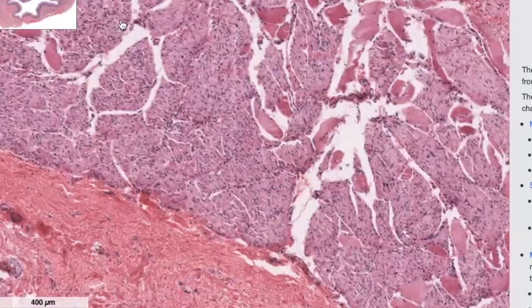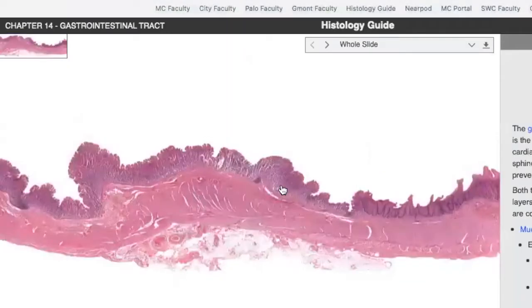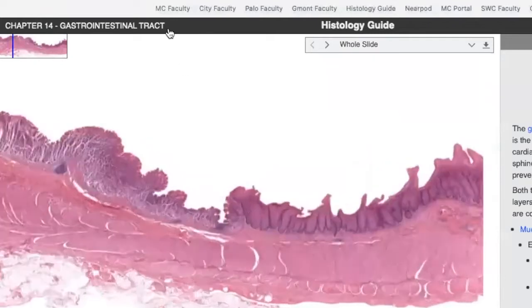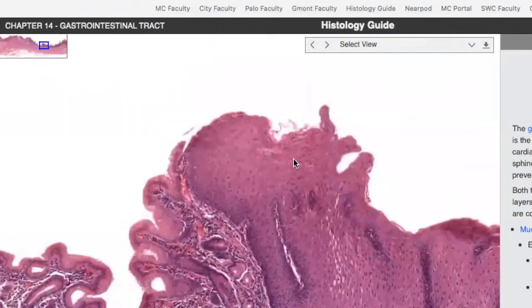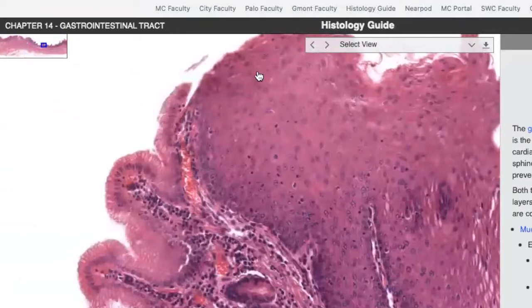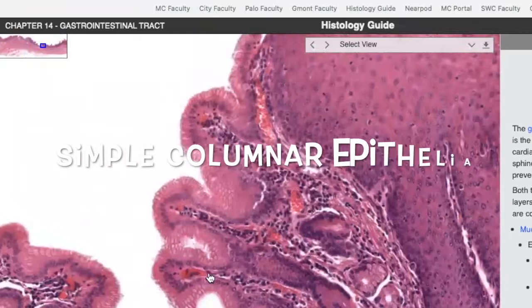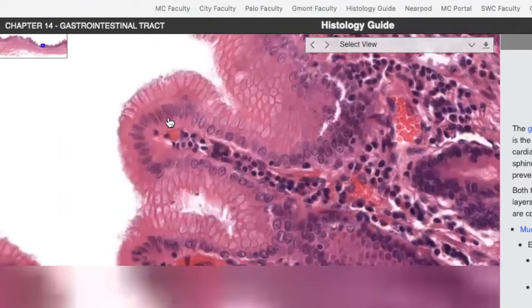Again, I'll use better, easier samples for all this. For the muscularis layer, but that's good submucosa, right? And then we're going to get to the junction again. You're going to go from a stratified squamous to a simple columnar, right? We look closely, right? We'll see that boundary between the stratified squamous, the esophagus, and then you'll see the simple columnar that's lining the epithelial here, right? So this would be the lining of the stomach, the structures, the small structures.